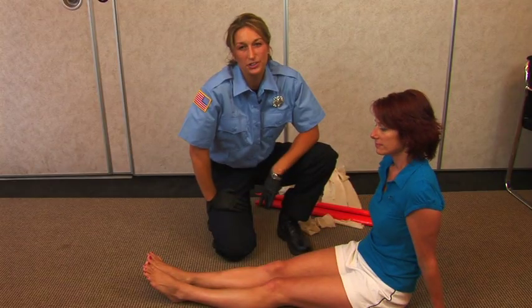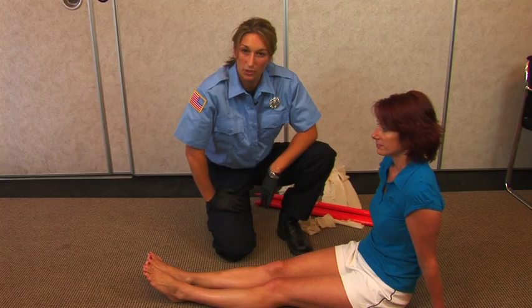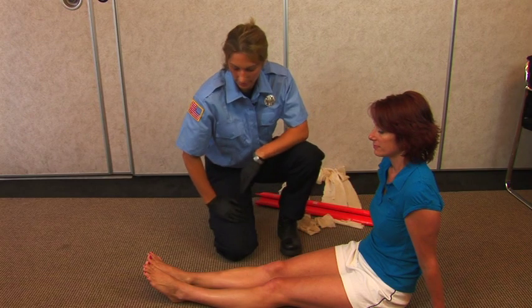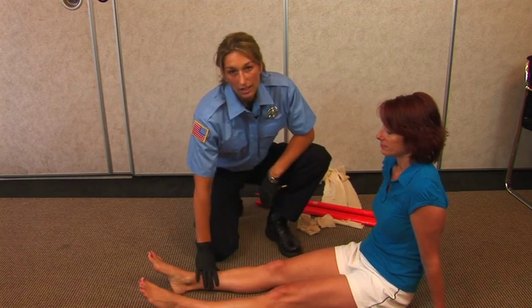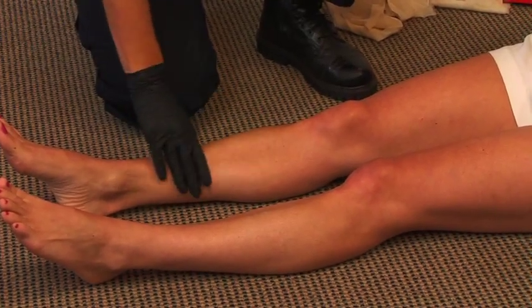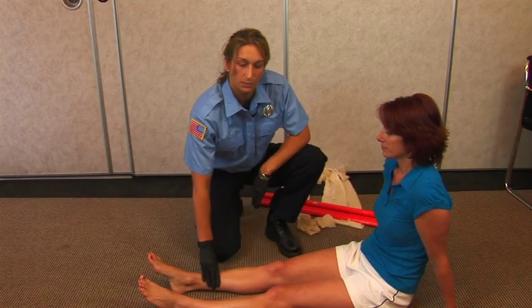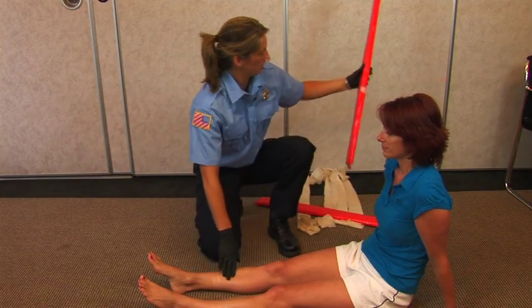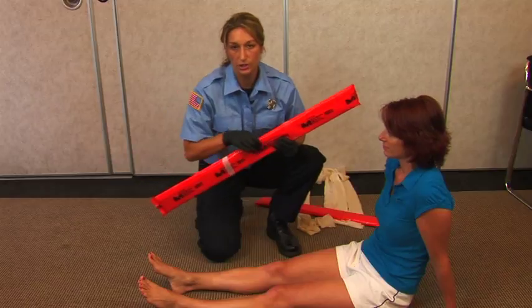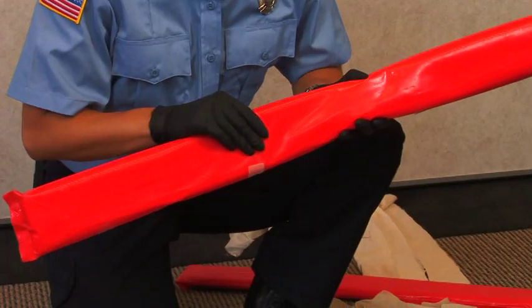When splinting a lower leg, please refer to your local protocols. First, assess the lower leg and see where the fracture is. If it's a closed fracture, you don't have to worry about putting any 4x4 gauze on it, and you should use a soft splint. This is a rigid splint with a soft side, and this is preferred.